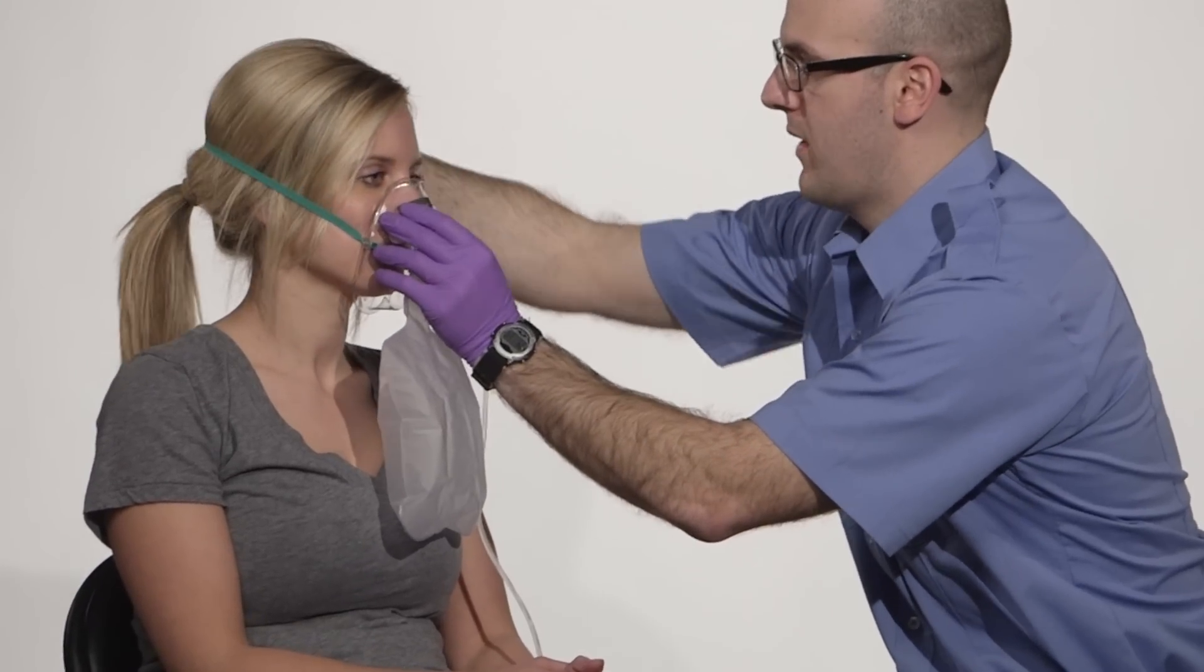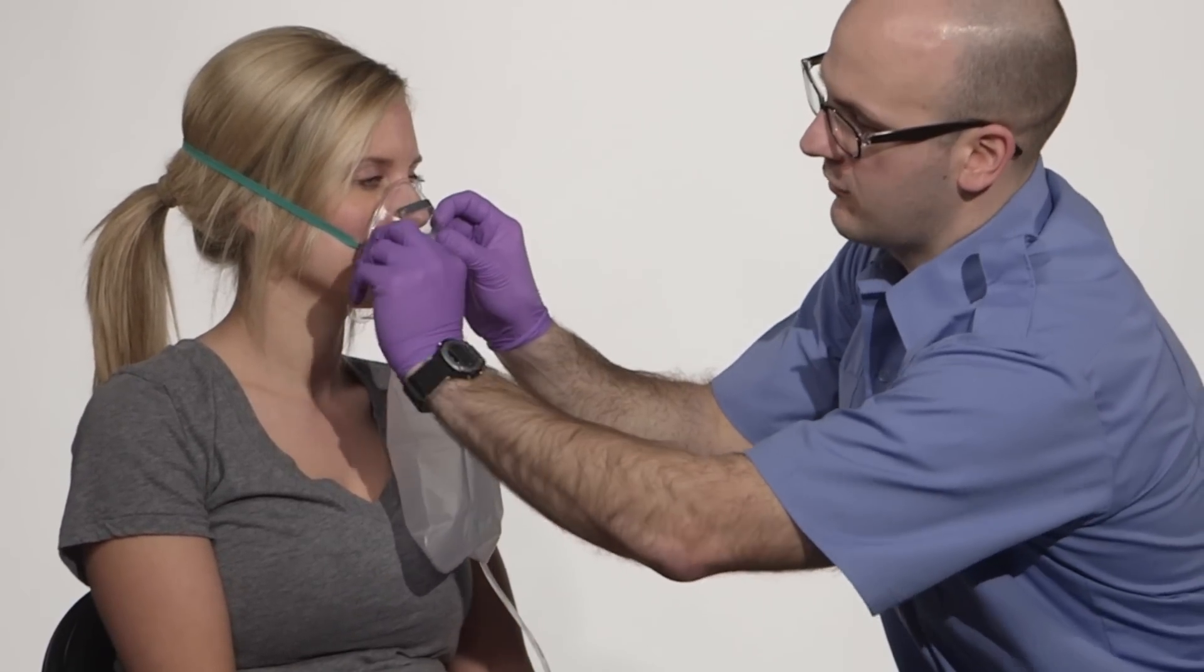Let's watch in real time as the candidate proceeds with oxygen administration by non-rebreather mask. This skill is designed to evaluate your ability to effectively deliver oxygen by non-rebreather mask to a patient in respiratory distress.